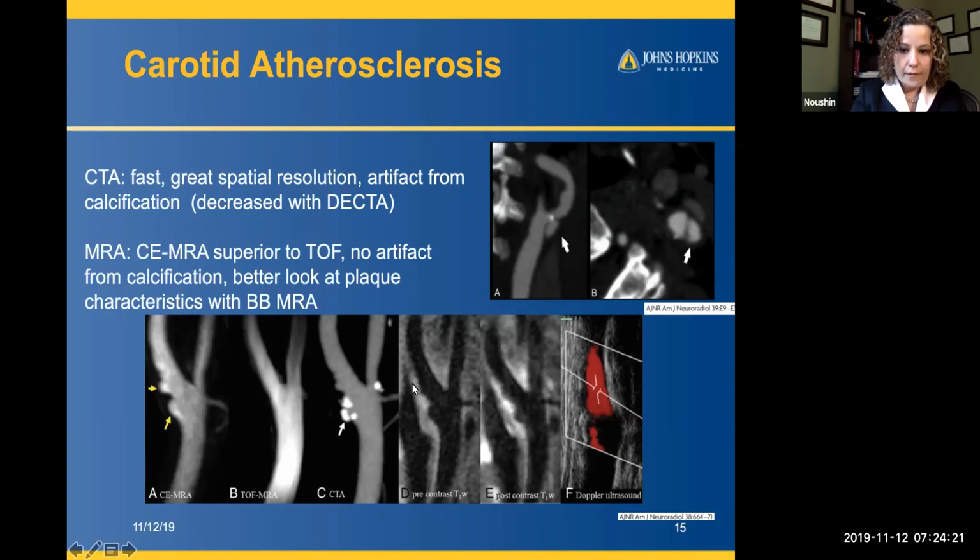With carotid atherosclerosis, we get outward remodeling of the vessel wall, meaning you see a large plaque burden that is beyond the vessel wall when you look at it. So it doesn't really cause much narrowing, but there's a big plaque, and as you can see, it's enhancing. In this example, Doppler ultrasound failed to show that the plaque was actually ulcerated. So again, each modality has its own benefits and limitations. It's important to know when we look at some images that there may be some limitations.